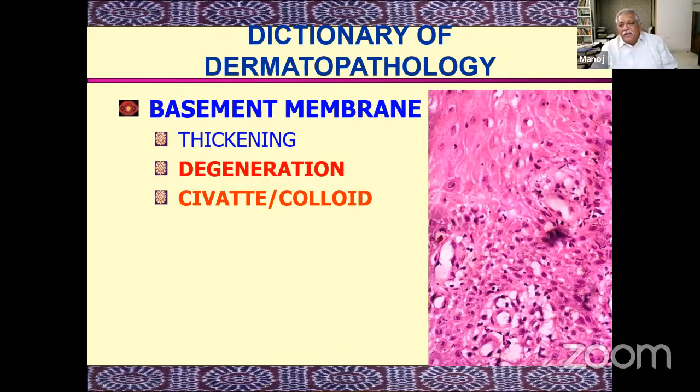Now, these are very interesting cells or remnants of cells called Civatte bodies or colloid bodies, in which the epidermal cells in the lower or the mid dermis, instead of maturing and going up like good boys, degenerate and fall down into the inflammatory infiltrate, and they form pinkish structures because the keratin has not degenerated, it has remained, the nucleus has died. So it's a small little bag of keratin, a Civatte body or a colloid body.